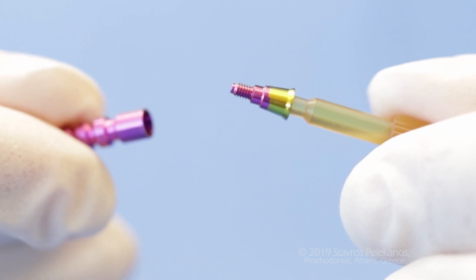I love to tighten this abutment with 30 newtons per centimeter, either at the time of implant placement or later at the second stage. And the whole work is done on top of this abutment.